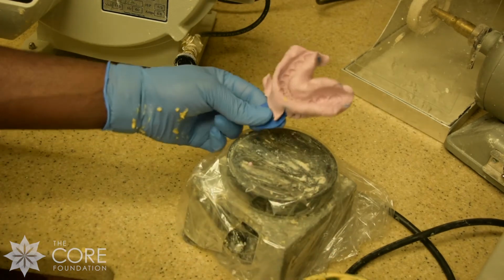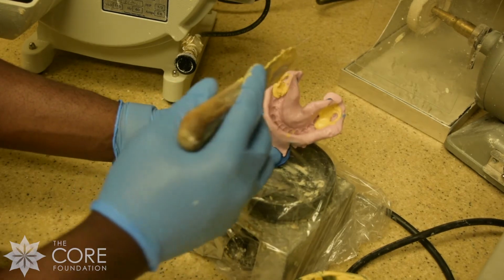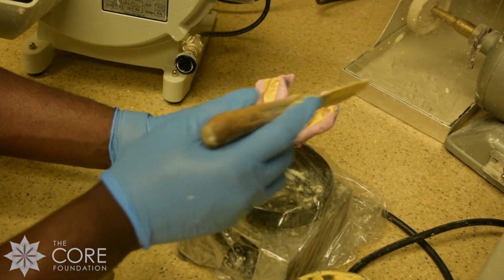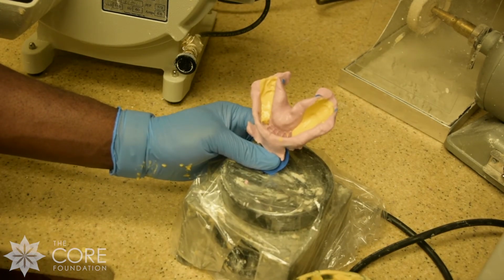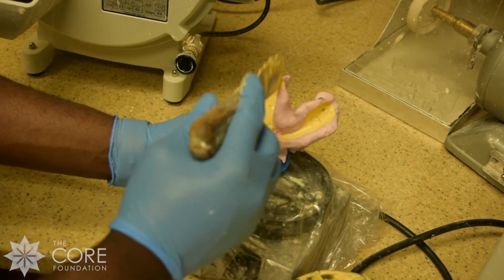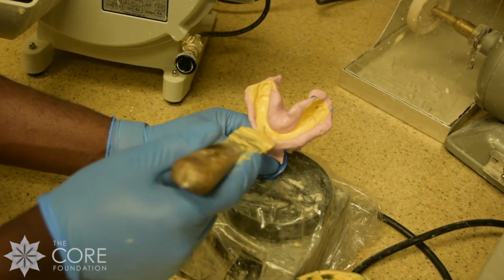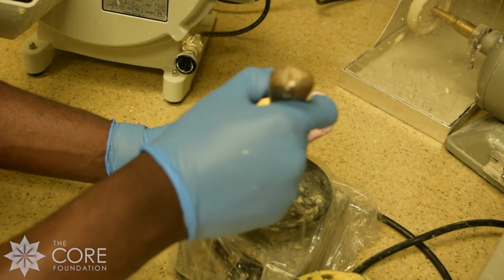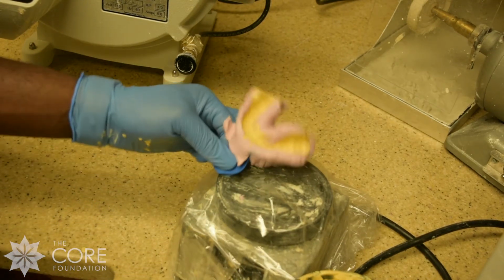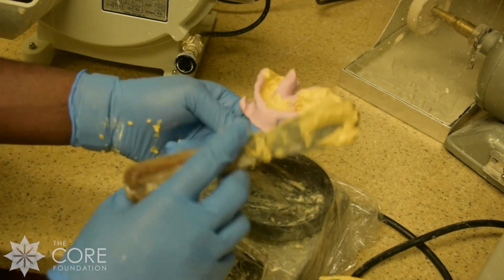We'll get the lower. Same step. Start with the posterior teeth. And as you can see over here, there's a bubble. So I'm going to just move it a little bit to make sure it all covers. Everything is covered really nicely. Then we're going to fill it all in.